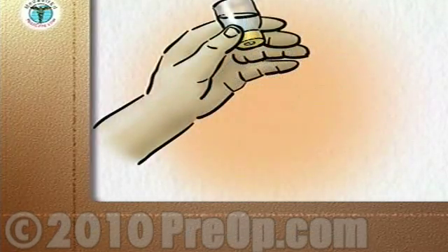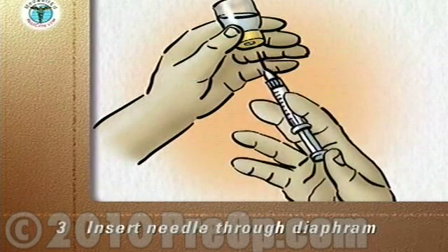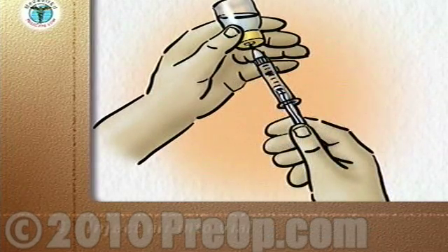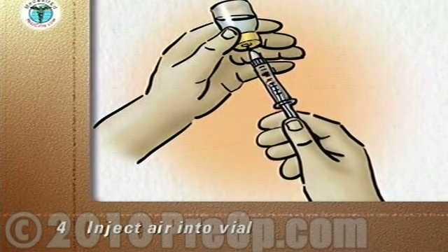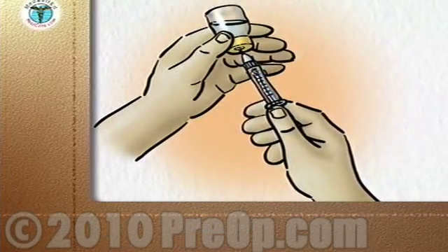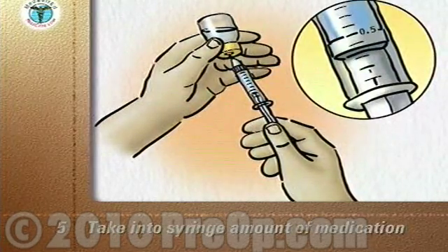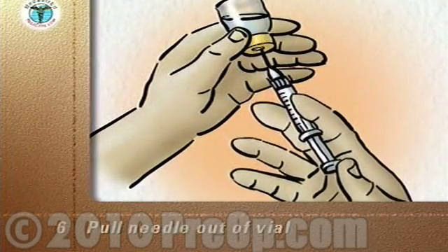Hold the vial upside down at eye level. Without touching the needle, insert it through the diaphragm of the vial. Keep the tip of the needle below the level of the medication in the vial. Depress the plunger to inject the air into the vial. Slowly pull down on the plunger to take into the syringe the amount of medication prescribed for you. Pull the needle out of the vial.